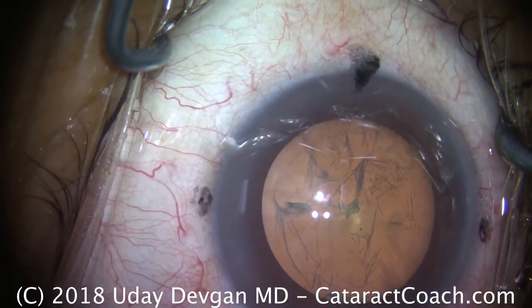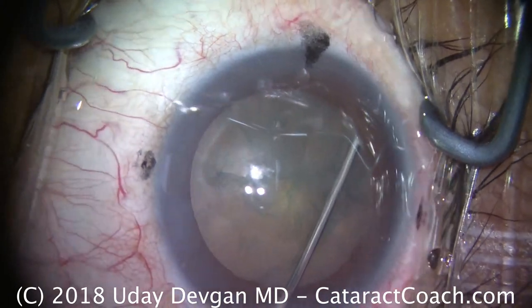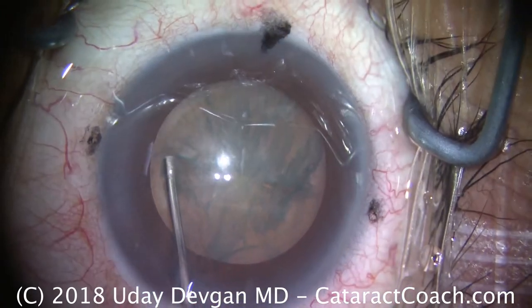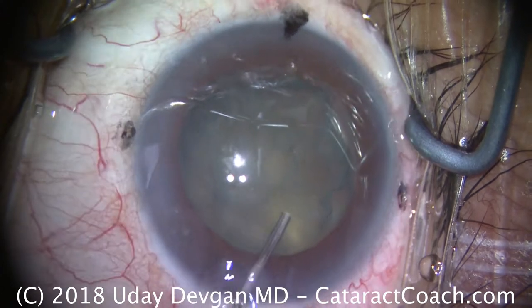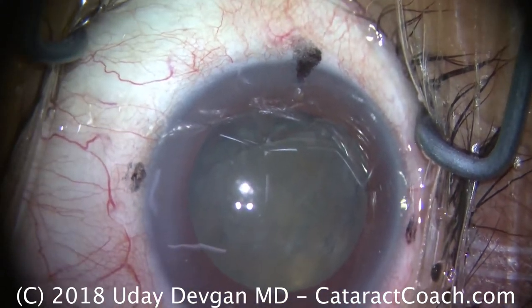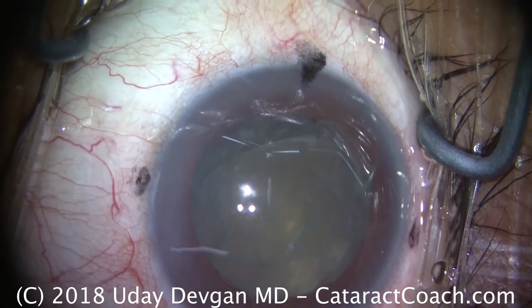This patient is actually a professor who traveled to see me from out of state. It's always a big honor to operate on a fellow professional and fellow professor. Hydrodissection is being performed to loosen the lens nucleus from the capsule. Here we've slightly prolapsed one end out of the capsule bag. Importantly, that was a recoat of viscoelastic for the endothelium.